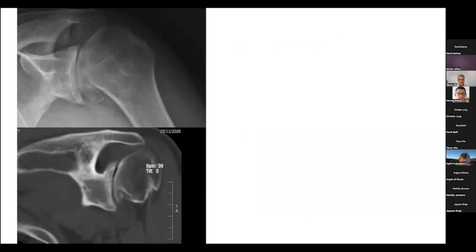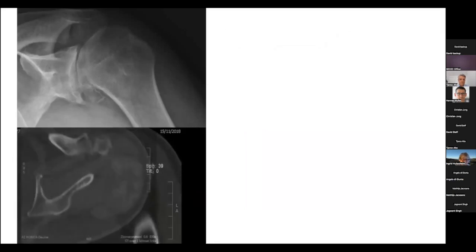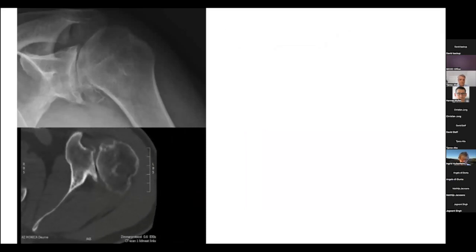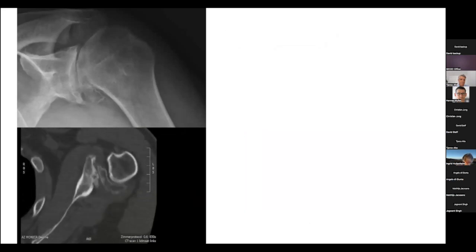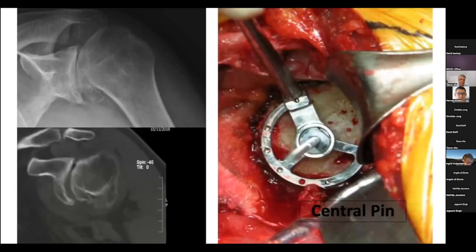In standard techniques, shoulder surgeons tend to plan this type of deformity looking at standard X-rays and CT scans and try to determine how the glenoid can be corrected and what type of implant can be positioned in the right position.